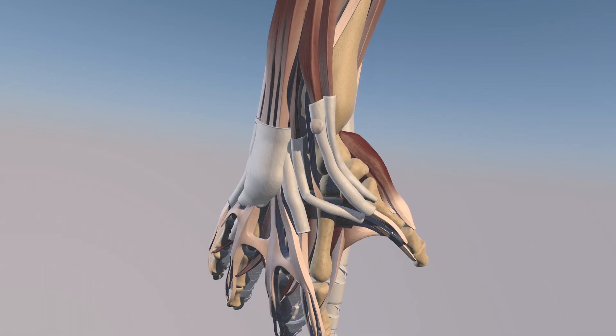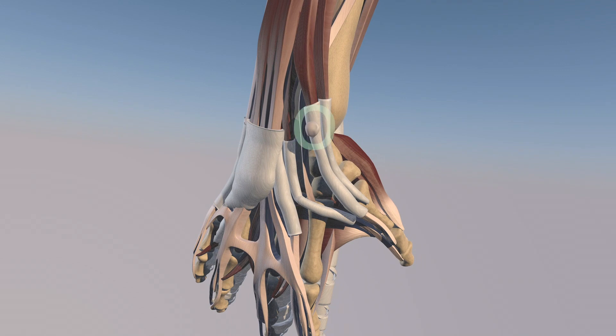Here we're going to go over de Quervain's tenosynovitis injection with a superimposed ganglion cyst, which you can see here over the extensor pollicis brevis tendon. Here's the abductor pollicis longus tendon with its surrounding tendon sheath.